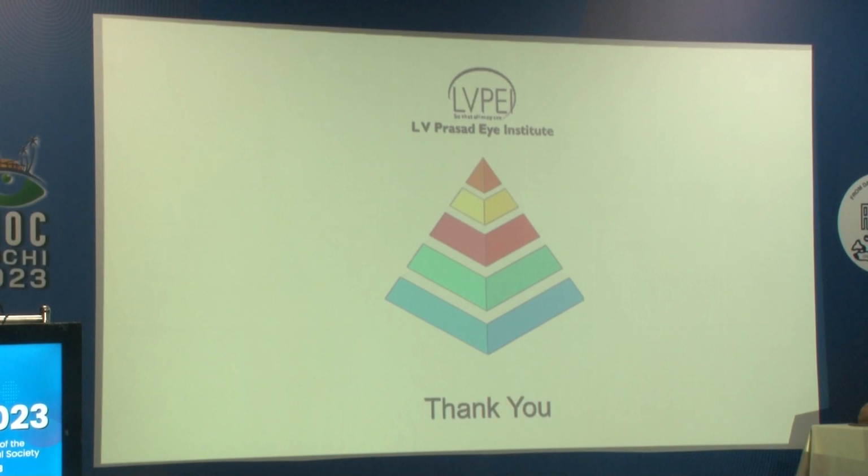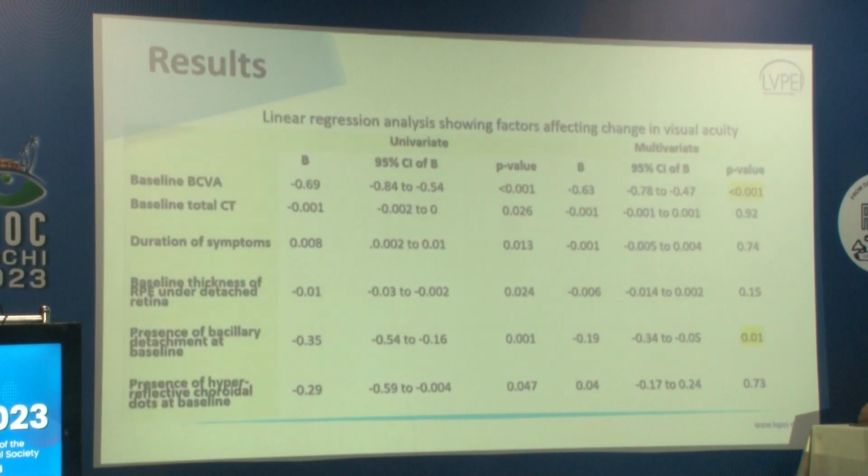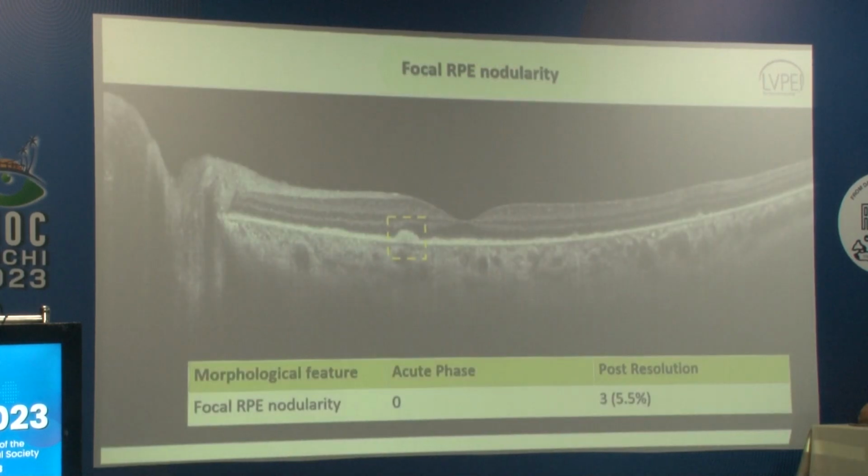In one of the photographs, you showed that RPE thickness was increased because of some depositions. So it could lead to false measurement like this. So we excluded this area, sir. This was just an image finding we noticed, and this is seen only in 3 eyes. So we excluded this to prevent any outlier value.